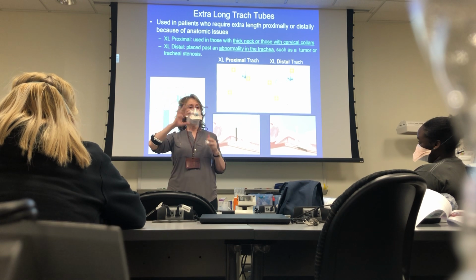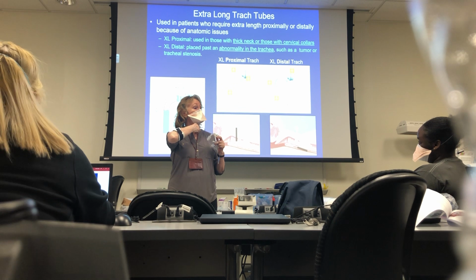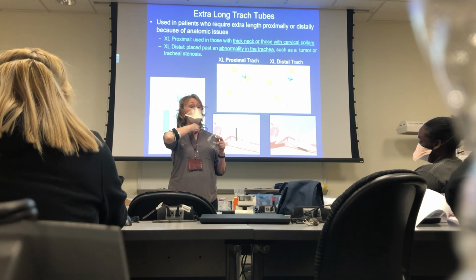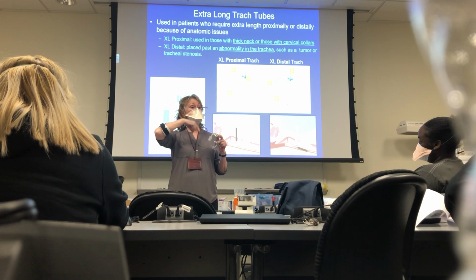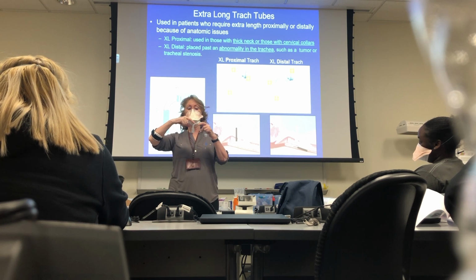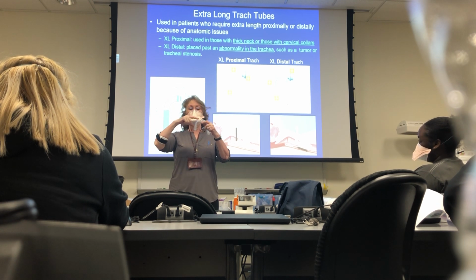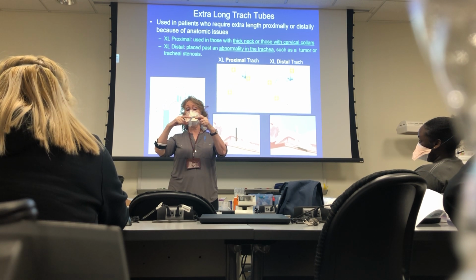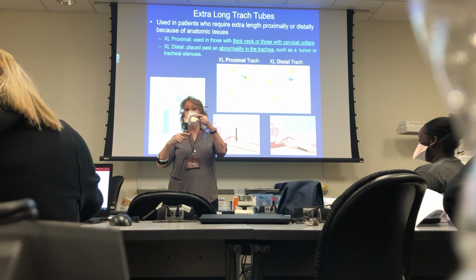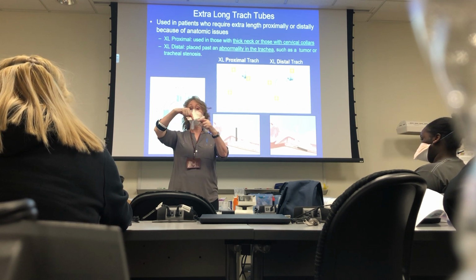If you have somebody that has developed some tracheal anomaly where we can't seal the cuff anymore, or they're extremely tall for some reason and it's not working well with the tube we have, it's leaking. No matter what, we're losing volume on the machine, we're getting a leak, they try the extra long distal. So extra long distal means it's longer from the elbow down to the end of the trach tube. Extra long proximal is from the flange to the elbow.